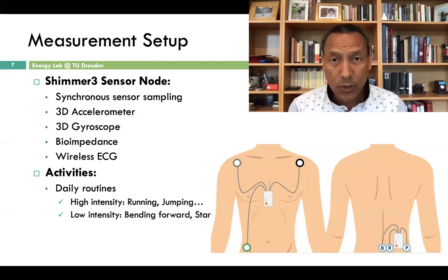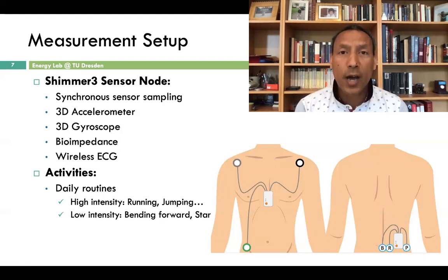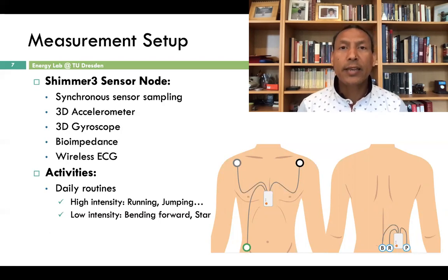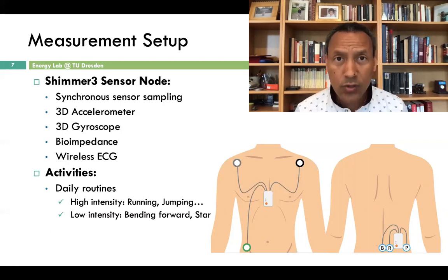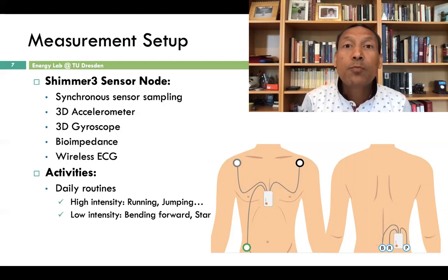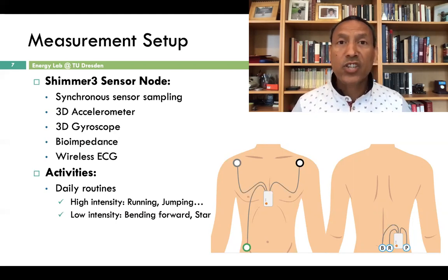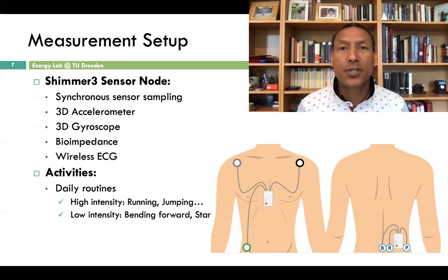So what we do is the following. Motion artifacts are results of human motion. If the person were not moving, then we hardly observe motion artifacts. So if a person is moving and this movement affected the electrodes, then we can measure the movement itself using some movement sensors such as accelerometer sensors, gyroscopes, or skin conductance, because when the person moves, the muscle move, and this muscle change the electrical activity of the skin.